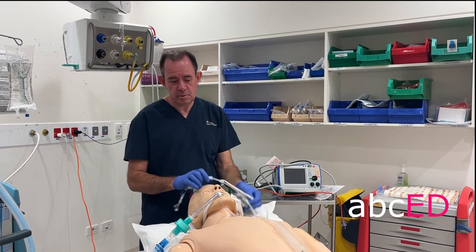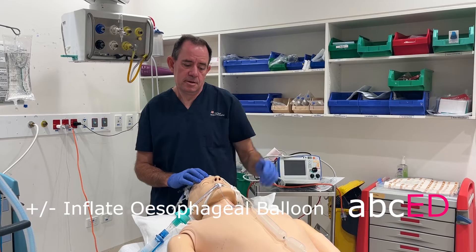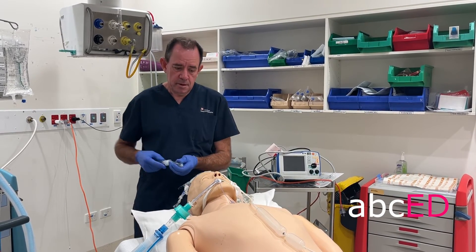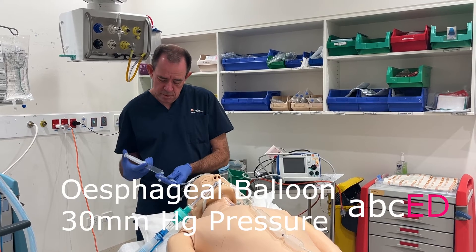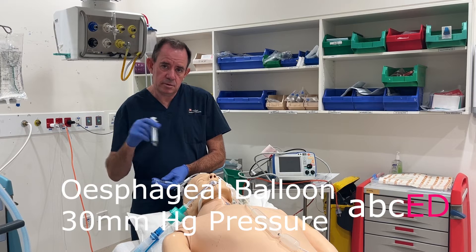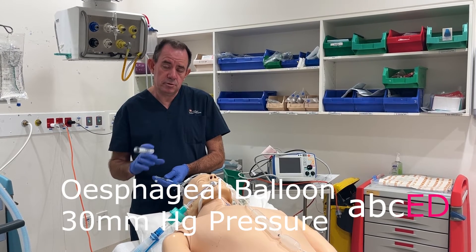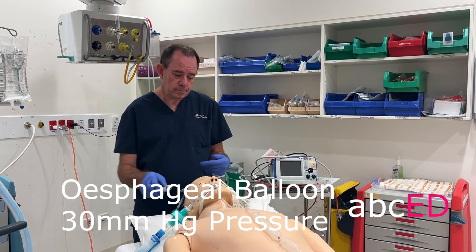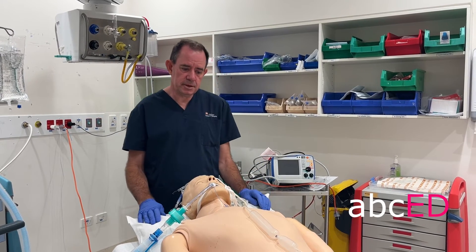In cases where that doesn't work, you need to inflate the esophageal balloon. This is done by inflating the esophageal lumen, and in this case we're going to inflate it to a pressure — not a volume — and the pressure using a manometer will be 30 millimetres of mercury. Once that's in, hopefully your bleeding is stopped.